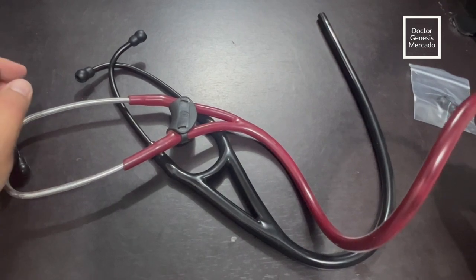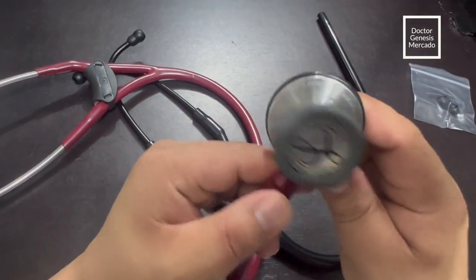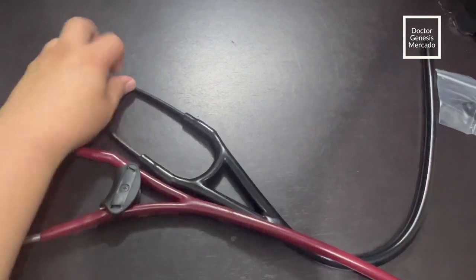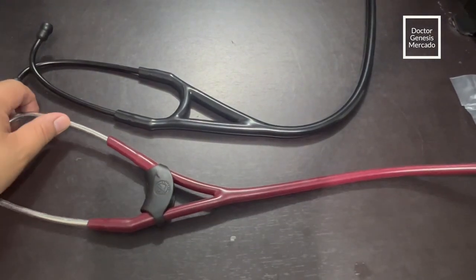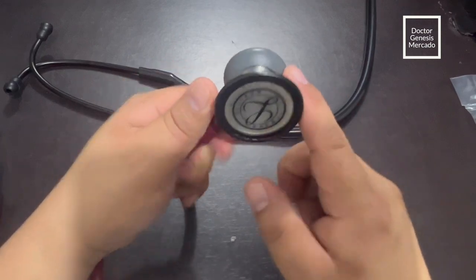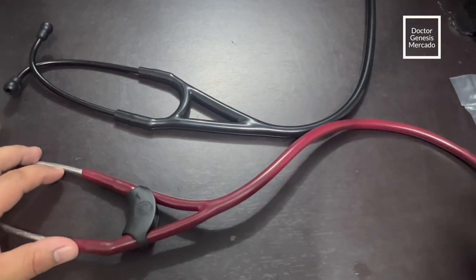For comparison, this is the original tube of my Littmann Cardiology 3 stethoscope. So they are similar, right? And this is a replacement part also. This is gray and this is the original color actually. Okay, so this is the tube for Cardiology 3.